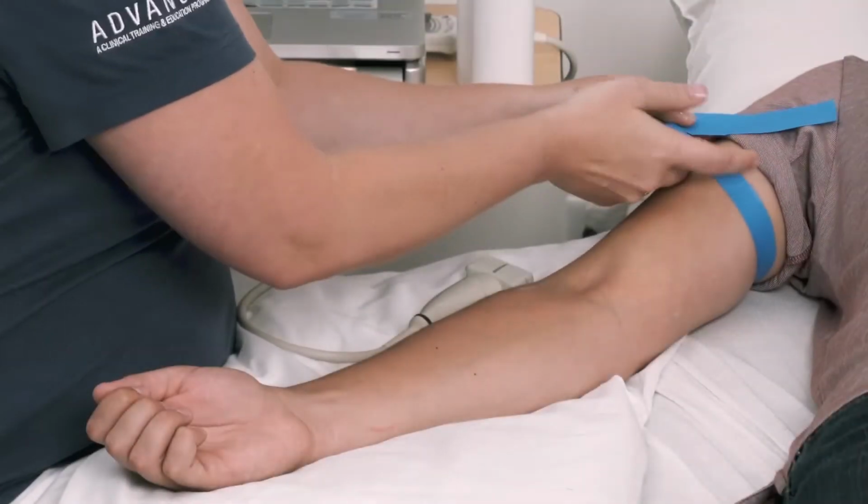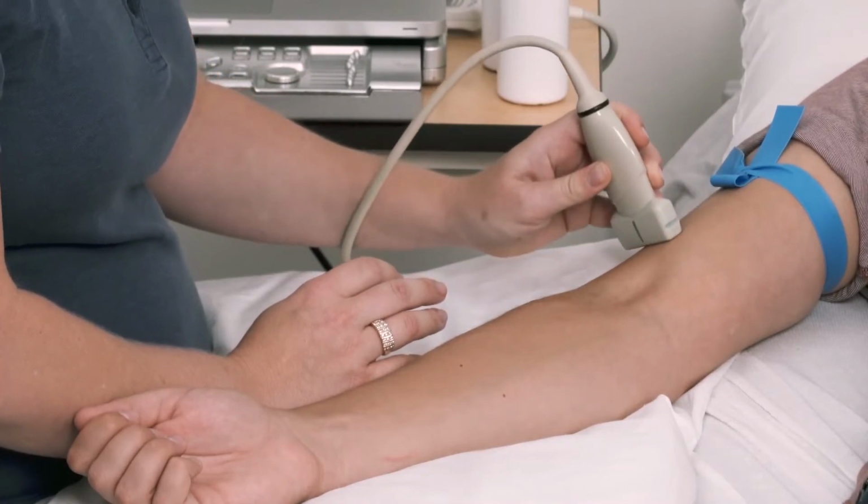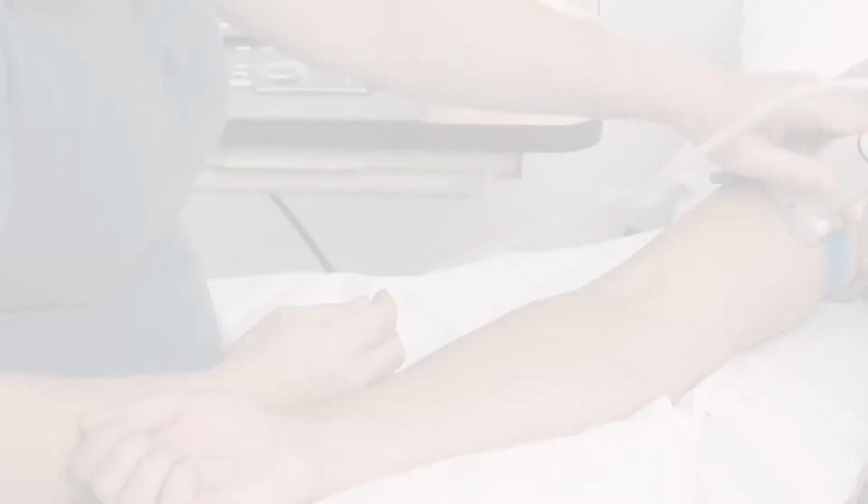Prior to vessel mapping, make sure you have placed a tourniquet on the patient's arm. Start vessel mapping by checking the venous outflow. Assess and measure the superficial cephalic vein, measuring proximal, mid, and distal locations in the upper arm. During this time, check for flow-limiting central venous stenosis. Then repeat this screening for the basilic vein.